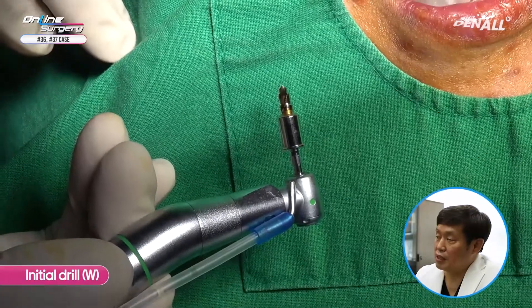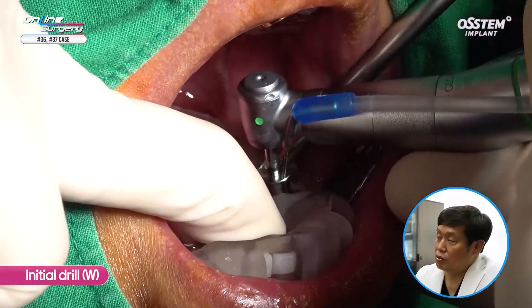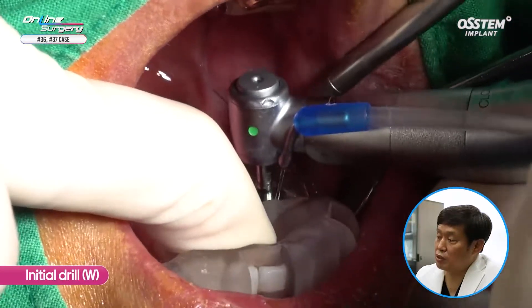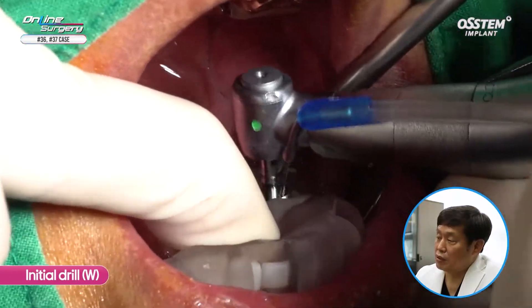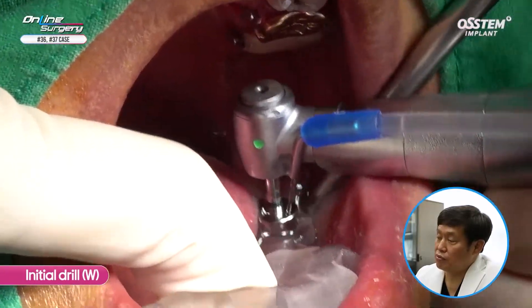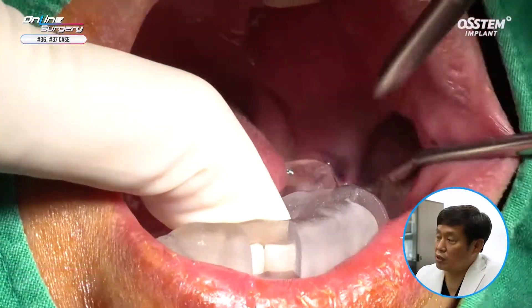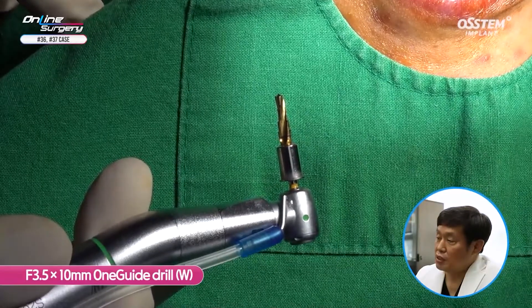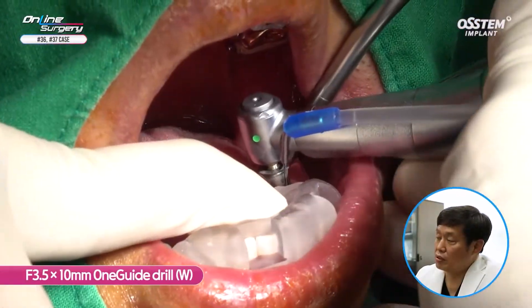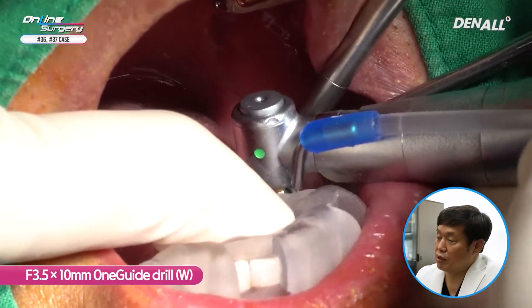An initial drill is used in number 36. Because I'm using a guide, pumping action is done to prevent heat generation — this is how initial drilling is done. In number 37, the same approach is used. Because it is a distal free-end case, in order to make sure the one guide template does not shift, you need to fixate it properly using your hand. A 3.5 x 10 mm one guide drill is used for number 36.